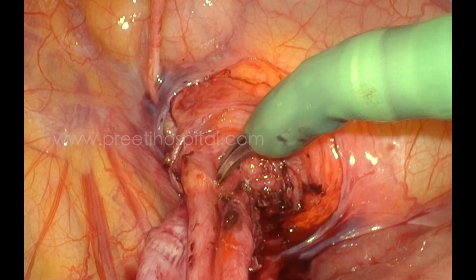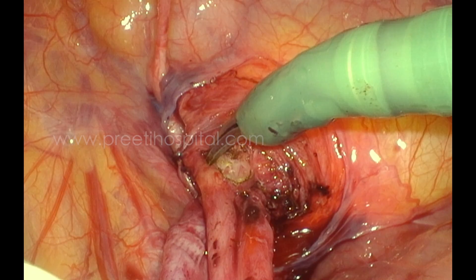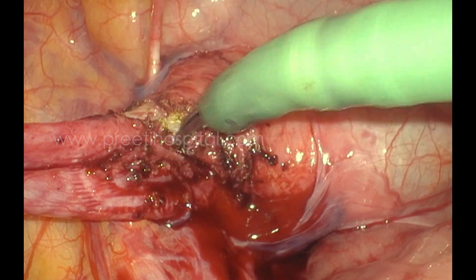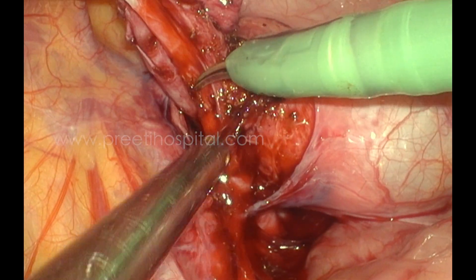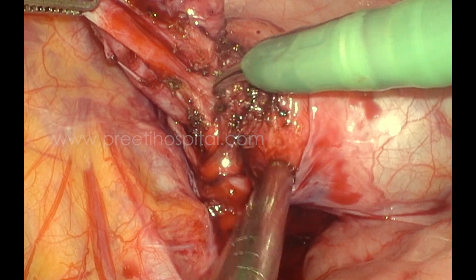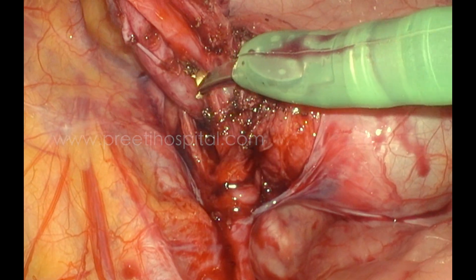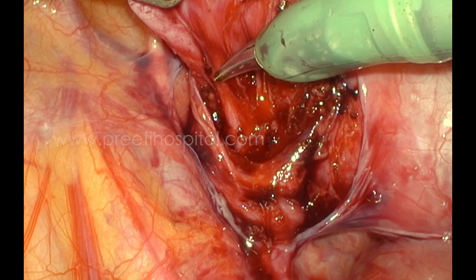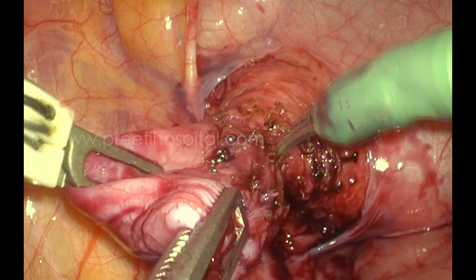In this process, none of the surrounding tissues are inadvertently included in the diverticulectomy. A little coagulation and a sweeping action helped us separate the tissue — in fact the detrusor was not cut at all in this case. With the robotic system, we could dissect well posteriorly, medially, and all around.